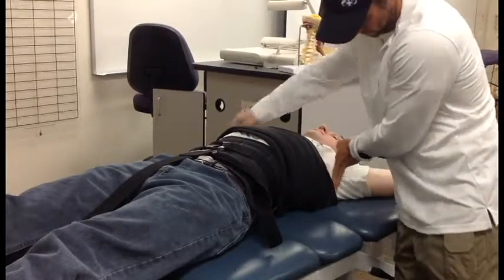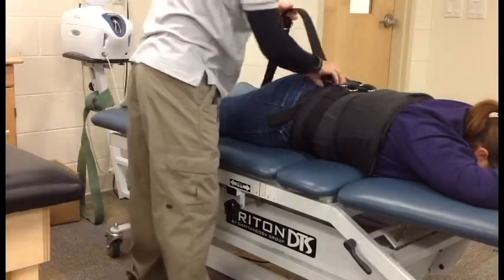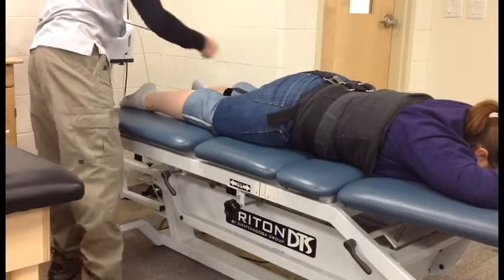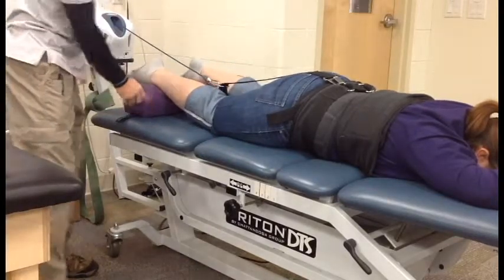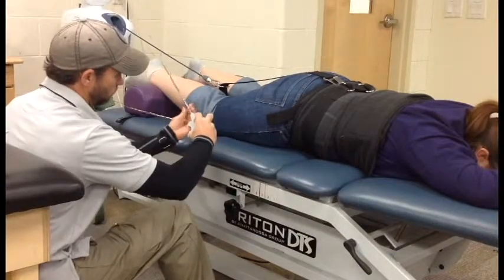below the axilla. If the patient is in the prone position, after the harnesses have been cinched into place, connect the J-hook to the center circle in the patient's back. Release the rope tension to connect the patient to the machine. Then place the bolsters under the patient's dorsal ankles. Ensure that the angle of the rope is correct and adjust the height of the table if necessary.